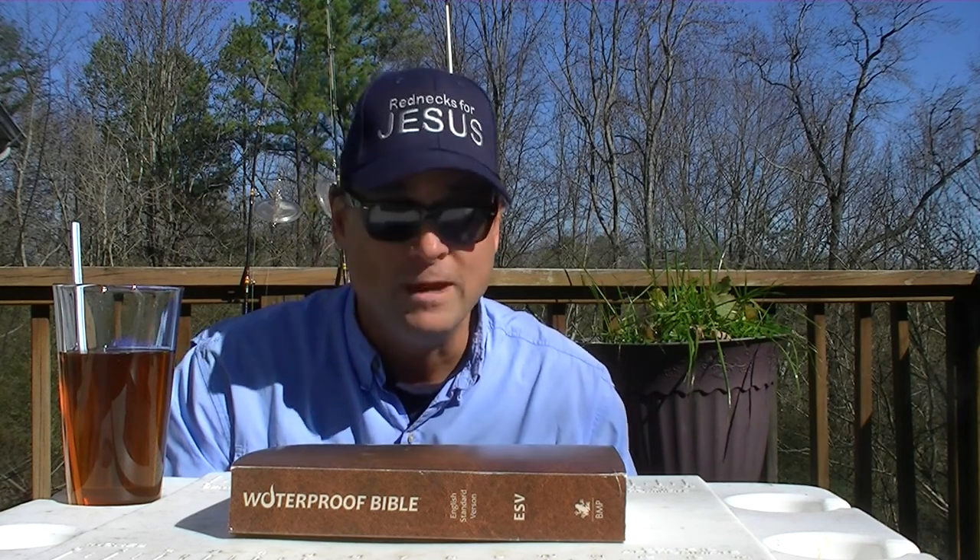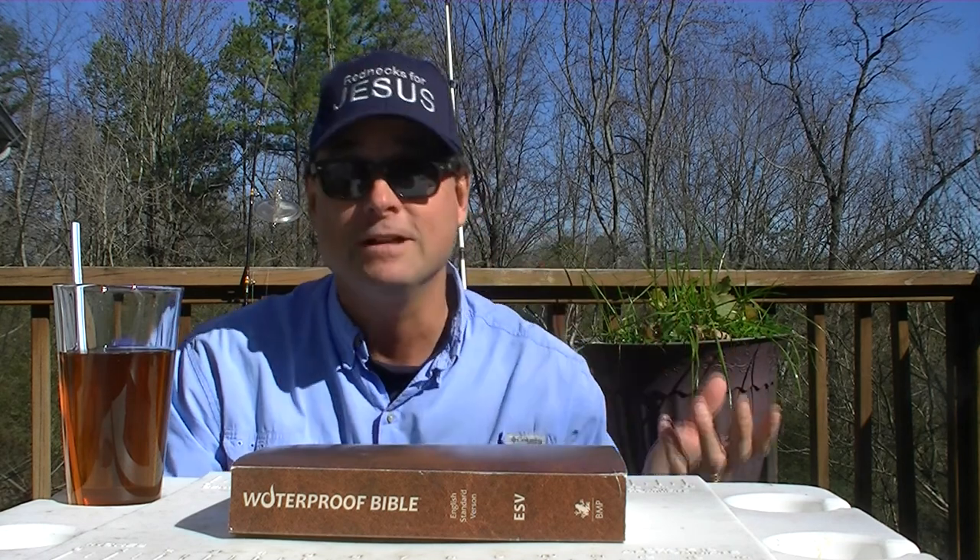When I compliment my wife and say, 'Hey honey, you look great in those Ray-Ban Wayfarers,' she says, 'Everybody looks great in Ray-Ban Wayfarers.' That's particularly true of the sunglasses. The clear glasses give you a little more of a Coke bottle or geeky, studious look.